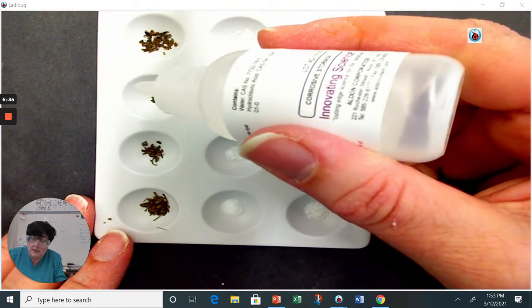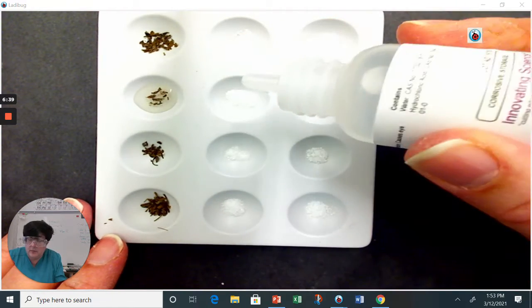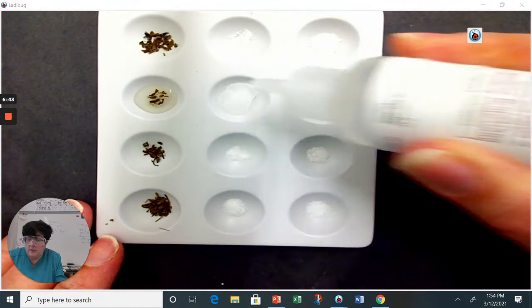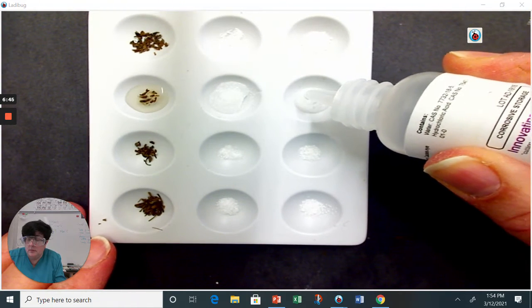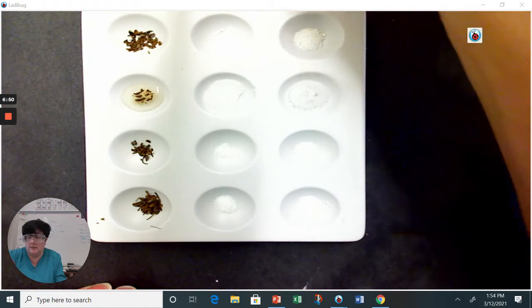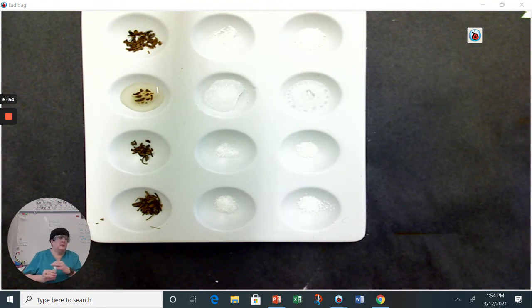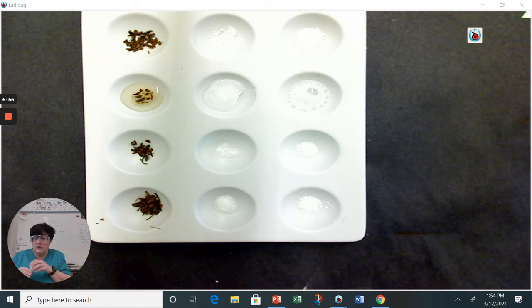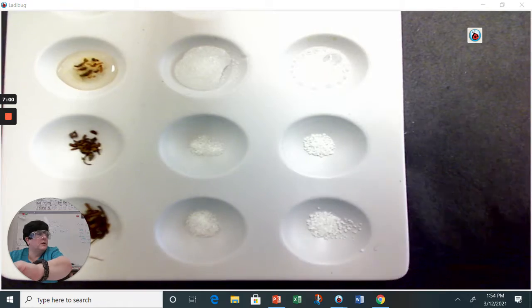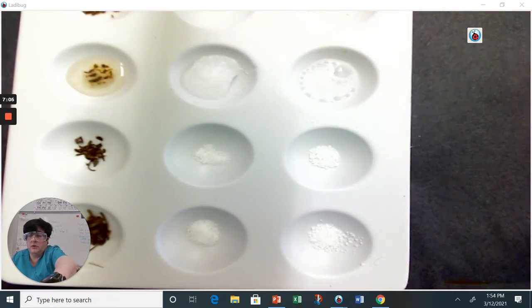So I'm going to go across with HCl, see if there is any reaction. Ooh, cocaine is bubbling. Well, that's interesting. I will try to zoom in for you. Get a little closer. Refocus. I'll poke it with one of my toothpicks.